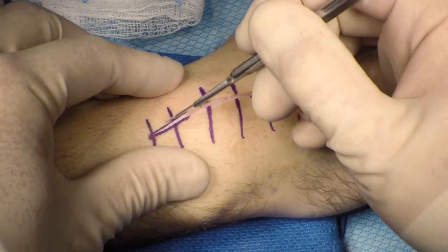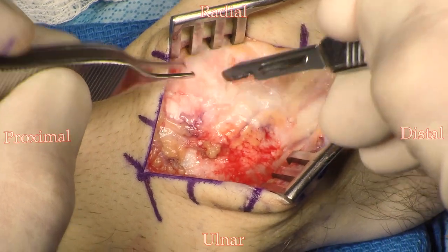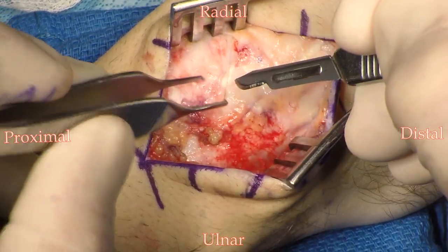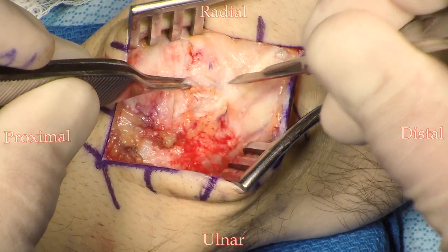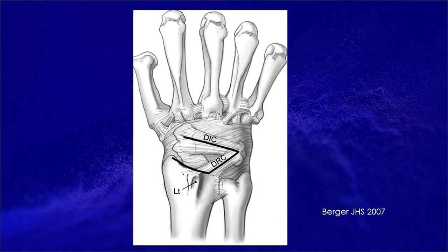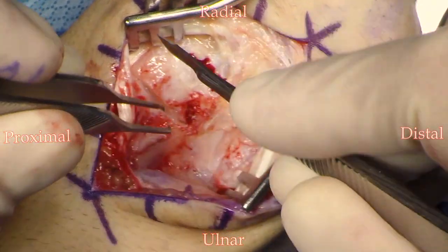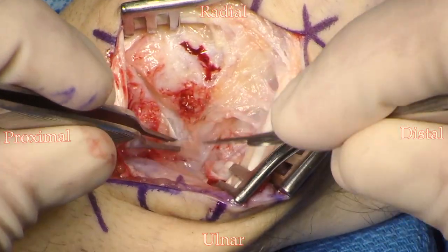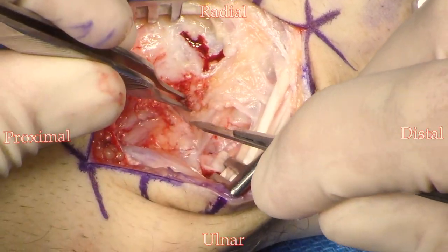The dissection was then taken down through the subcutaneous tissues. The retinaculum over the carpus is identified. The extensor pollicis longus is then dissected from the retinaculum along with the tendons of the fourth dorsal extensor compartment. A ligament-sparing capsulotomy is then performed, taken slightly ulnar and distal in order to get adequate exposure of the hamate. A transverse capsulotomy is made in line with the radius, just distal to the radiocarpal joint, leaving a small cuff of tissue for later repair.